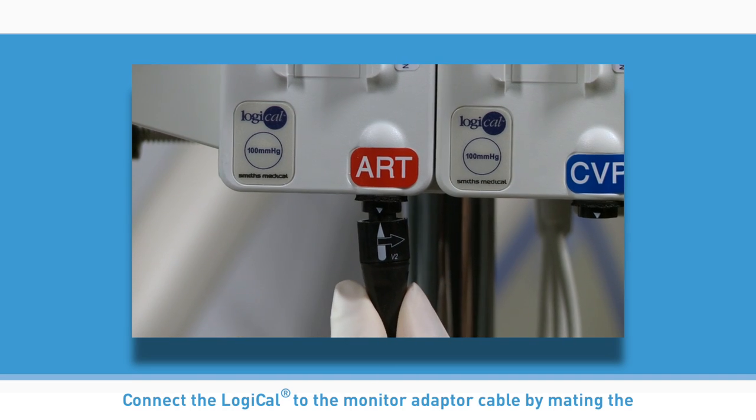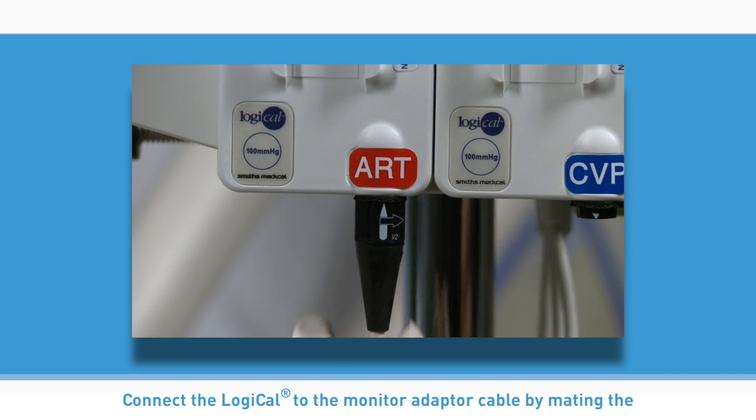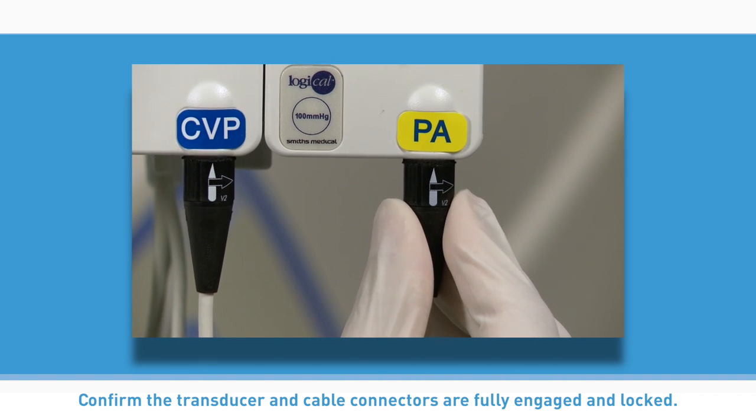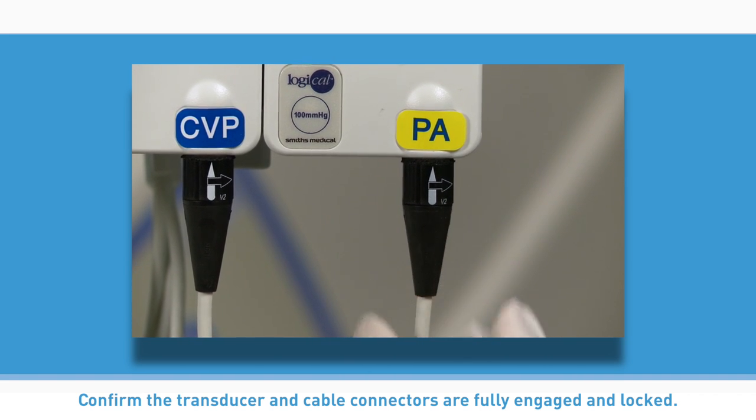Connect the Logical to the monitor adapter cable by mating the reusable cable connector with the transducer connector. Confirm the transducer and cable connectors are fully engaged and locked.